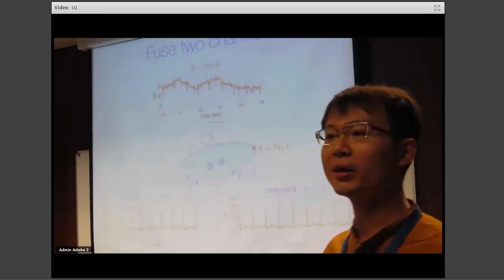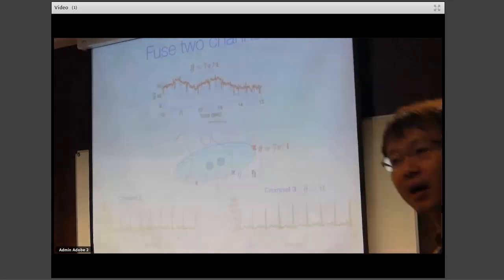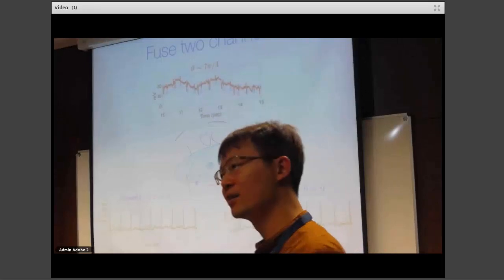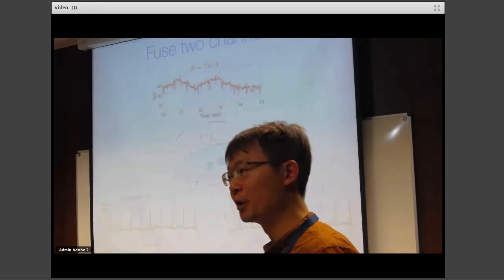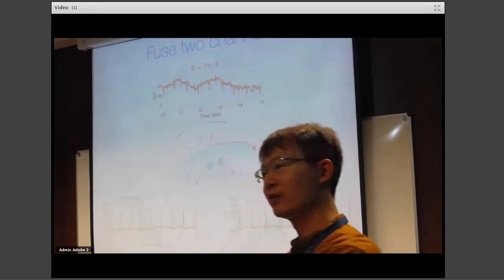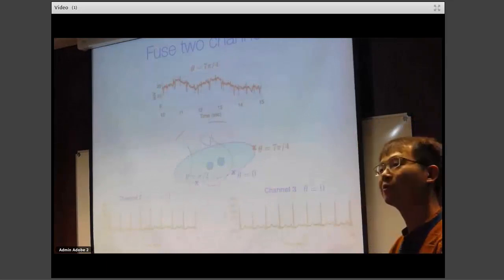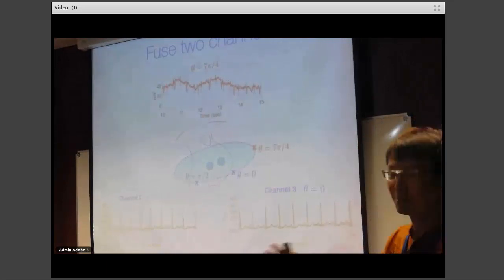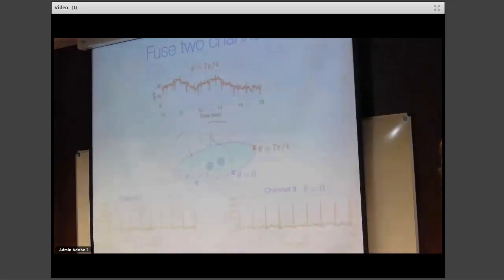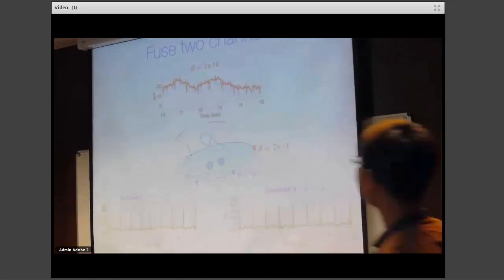So what it means is, when you are recording the fetal ECG, maybe the dipole current of the fetus is kind of perpendicular to your recording. But if you have two channels, then you can cover most of the possible directions, most of the possible information. You have 3 channels, 4 channels, the more the better. But 2 channels, based on our experience, is good enough to recover most of the information we are interested in. So we focus on 2 channels.